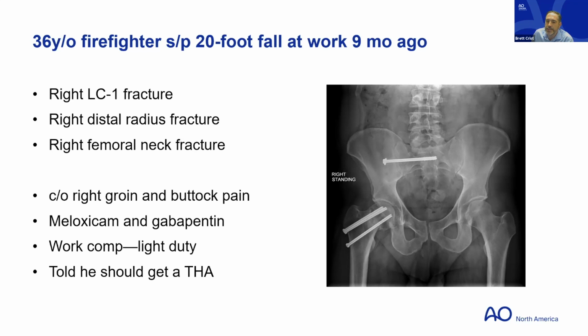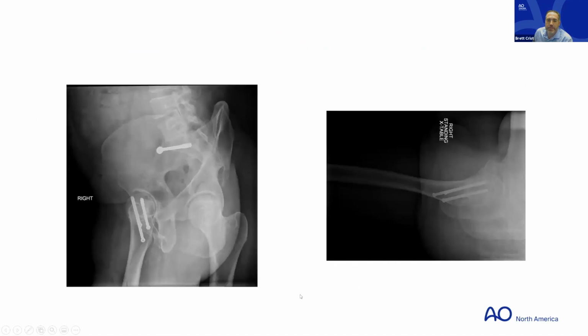The trauma surgeon that fixed him asked if he could come see me. So he has the impression that total hip is the option, but doesn't really want a total hip at 36. I just get a young adult hip series for these hip pain patients that are less than 50. So this is false profile and cross table lateral views.